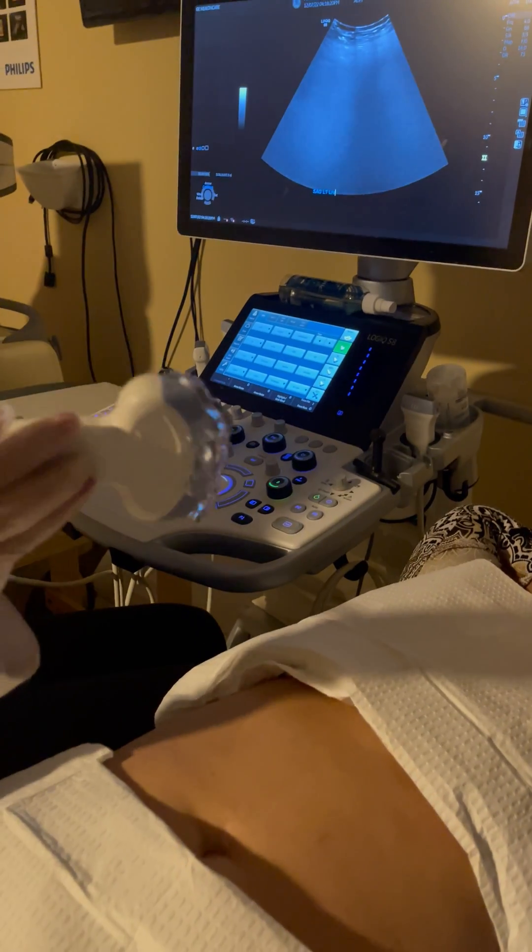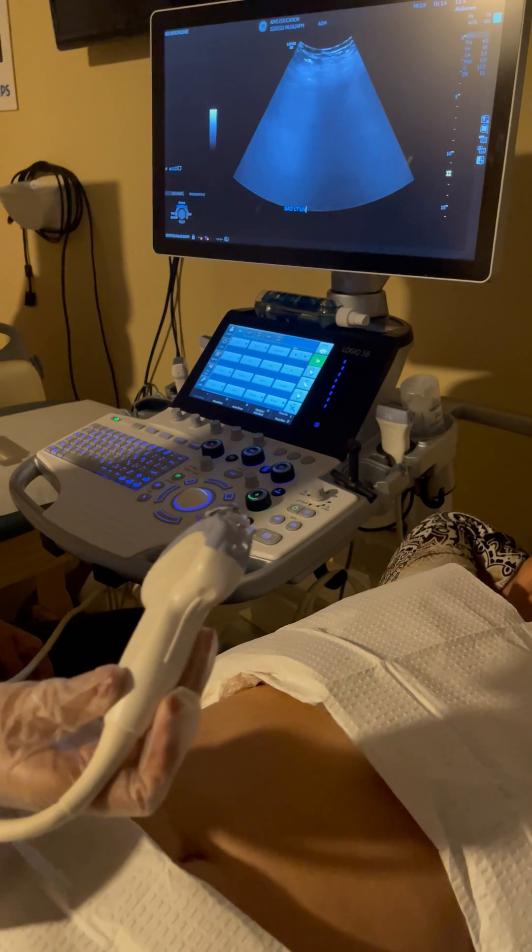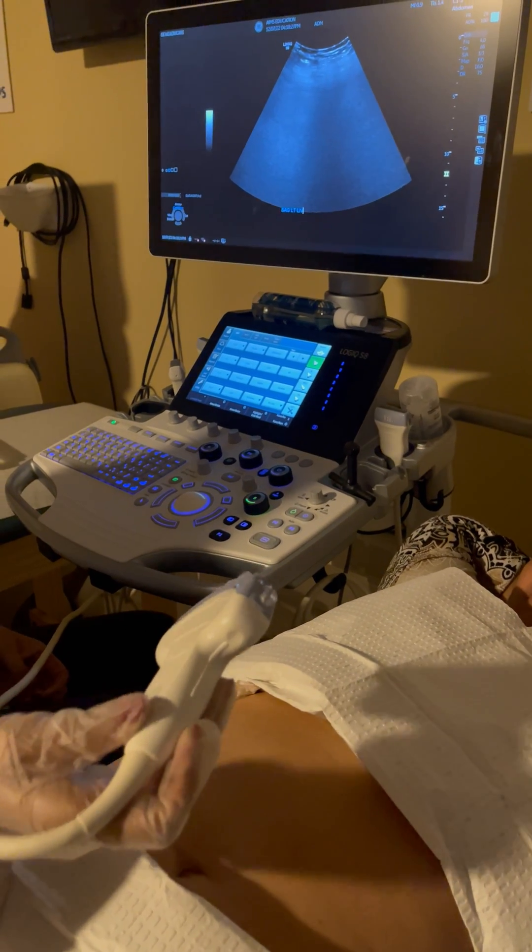This is a tutorial for how to scan the liver protocol. The liver has two lobes — left lobe and right lobe — and there is an additional small lobe which is the caudate lobe.